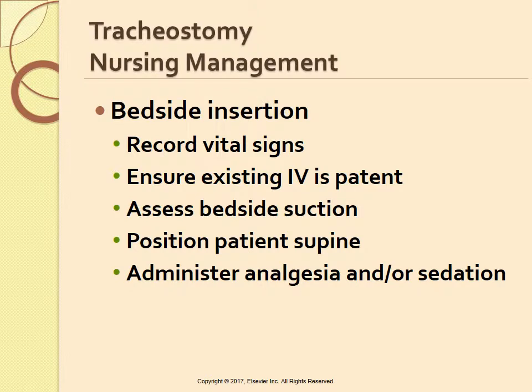If the procedure is being done at the patient's bedside, ensure all appropriate personnel, including respiratory therapy, have been notified. Emergency resuscitation equipment, including a bag valve mask, should be readily available.